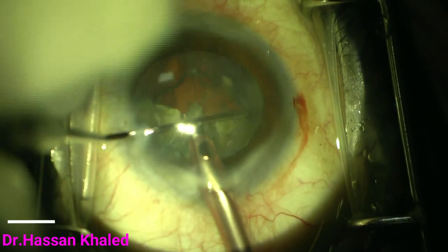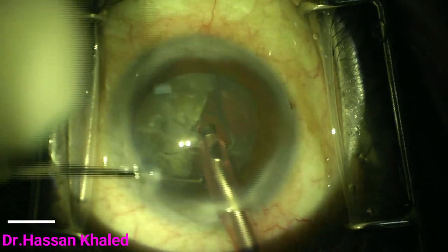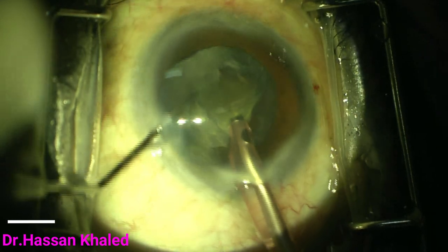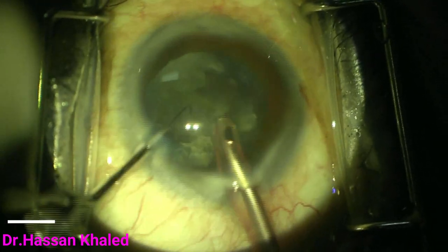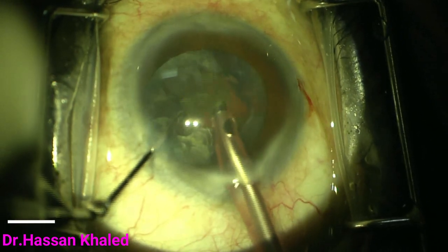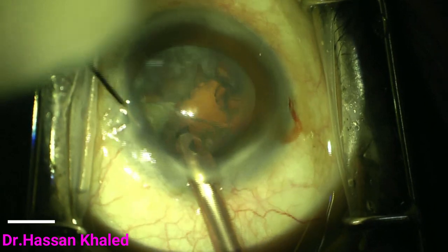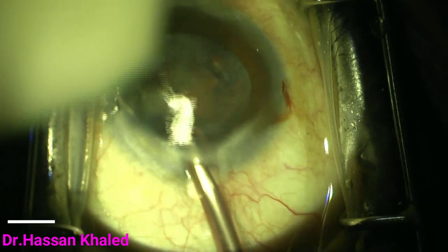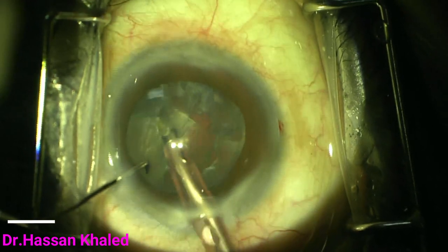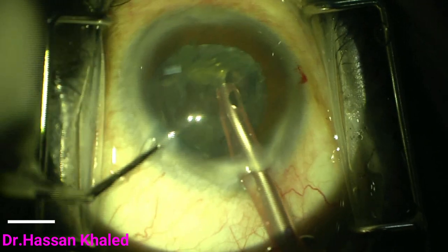Then rotation and complete emulsification of all pieces in the same way. The vertical chop technique is an excellent technique that is particularly important for complicated cases such as brunescent cataracts, white cataracts, cases with weak zonules, when you have a capsular rhexis tear, and also when you have smaller pupils.